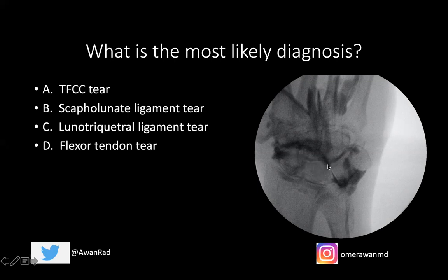In fact, we can actually see contrast here outlining the lunotriquetral ligament, and we can see contrast going from the proximal carpal row to the mid-carpal row through the lunotriquetral space between the lunate and triquetrum. So this is a lunotriquetral ligament tear. If we saw contrast going through the scapholunate interval from the proximal to the mid-carpal row, that would be a scapholunate ligament tear.